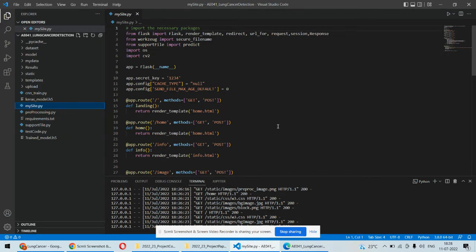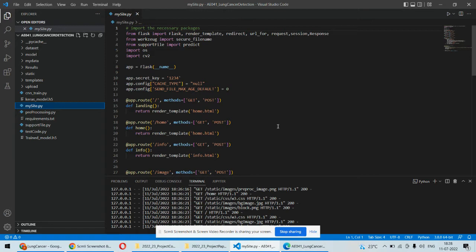There are some Python scripts as well as some static and template folders in which we are having the front-end part like HTML and CSS coding. And the rest of the folders are related to datasets and some trained models and Keras models we are having over here.